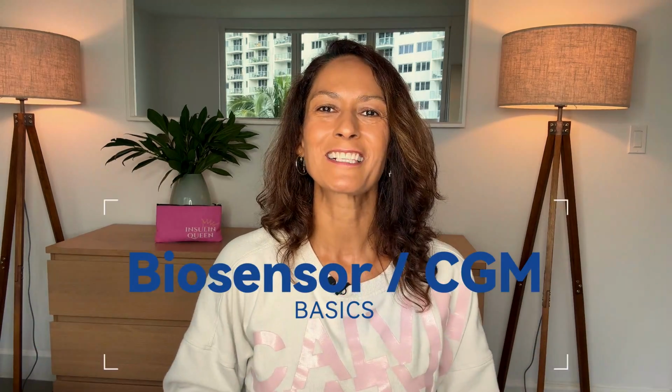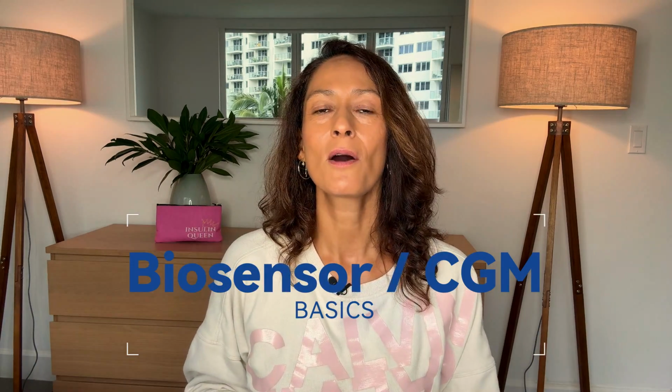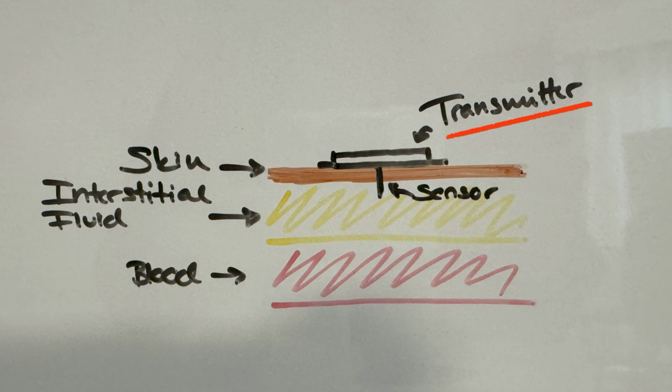Just to make sure that we're all on the same page, there's probably a few things that you need to know in order to completely understand the purpose as well as the power of biosensors and CGMs. You wear a transmitter on the body, and it has a small sensor attached that sits underneath the skin, and that sends your blood sugars 24/7 to the Dexcom Stelo app. You have to be within 20 feet of your phone to get readings. It does not measure your blood sugar in your blood, but in the fluid underneath your skin. And this is why if you do a manual test with a finger stick, this won't always match the Dexcom Stelo reading, but it can still be considered accurate. I'll talk a bit more about accuracy later on in this video.